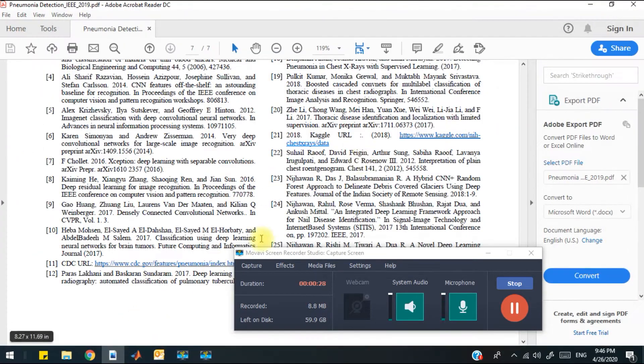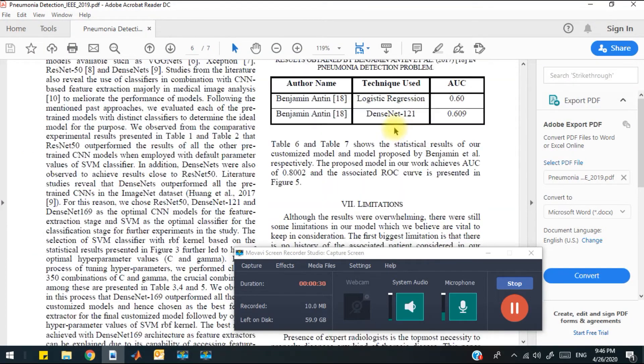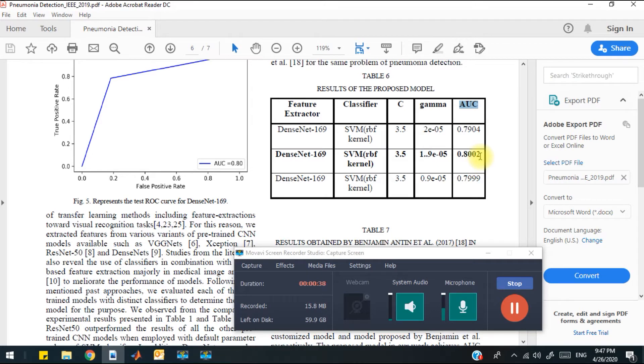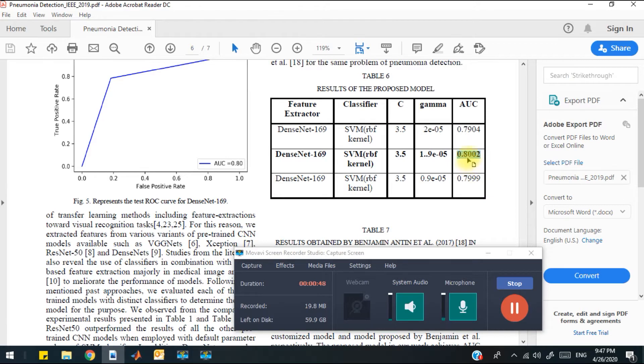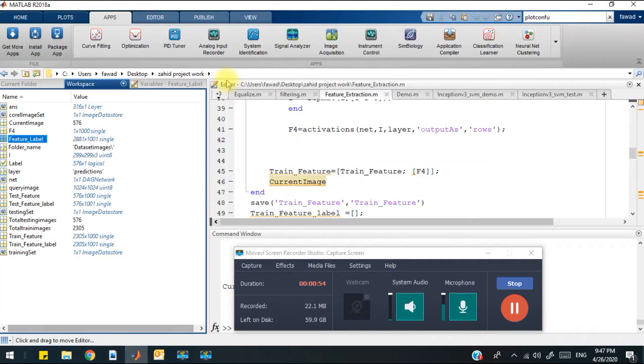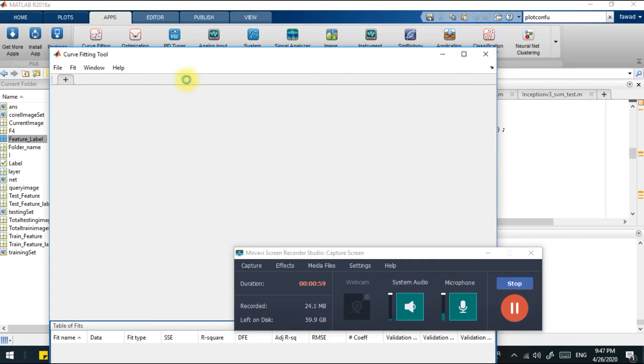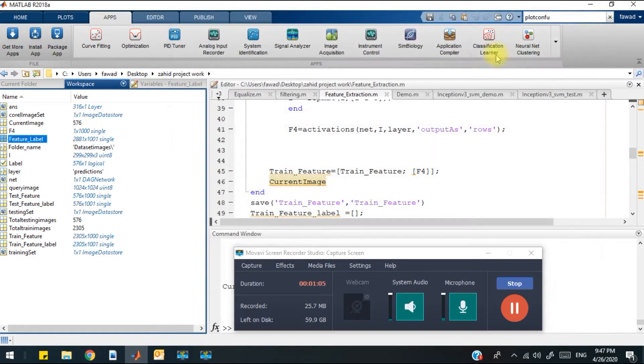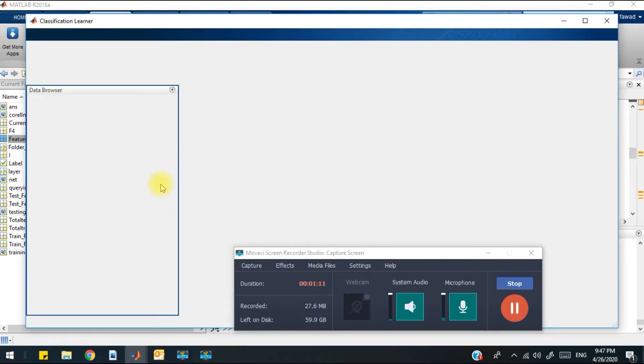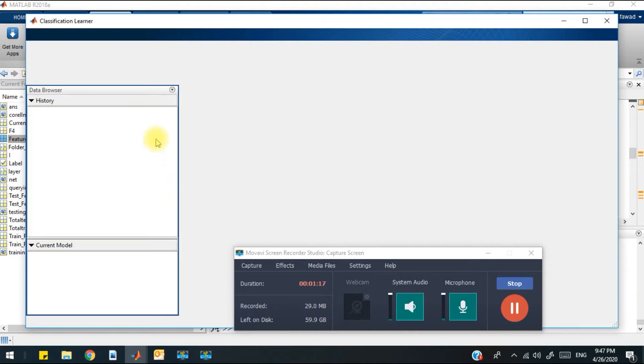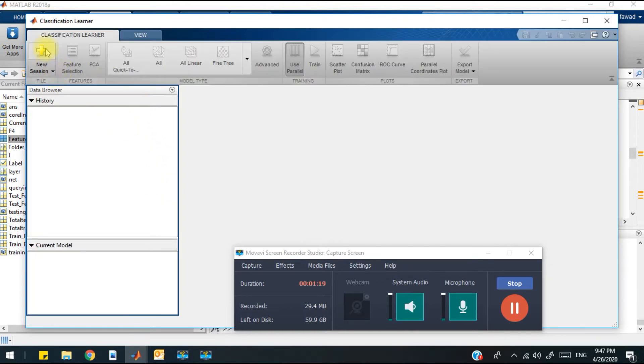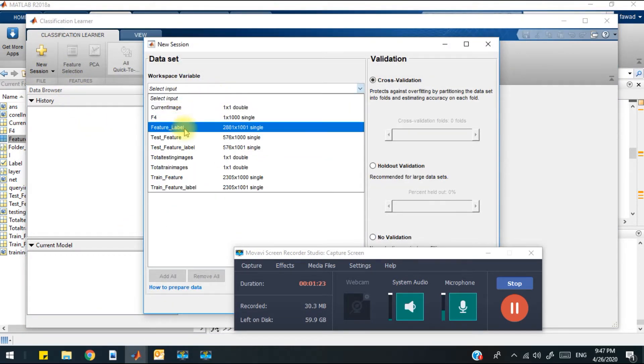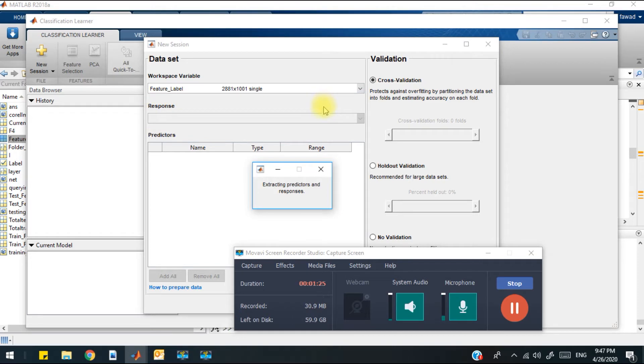The main aim of this task was to improve the accuracy, to improve the area under the curve value beyond 0.8002. So now I will see how much accuracy I have achieved. First of all, I will open the classification learner from here, then I will load the final feature and label matrix.